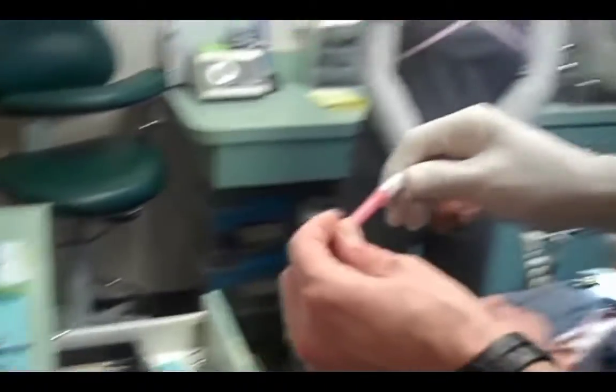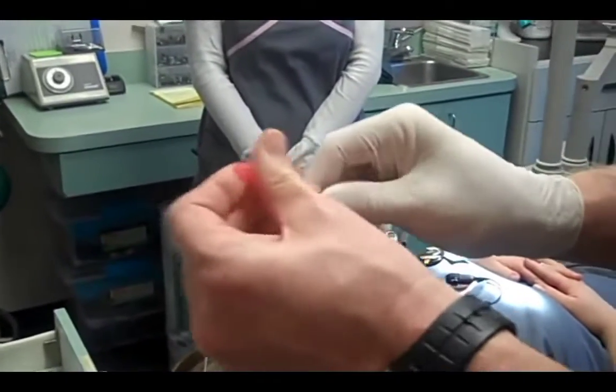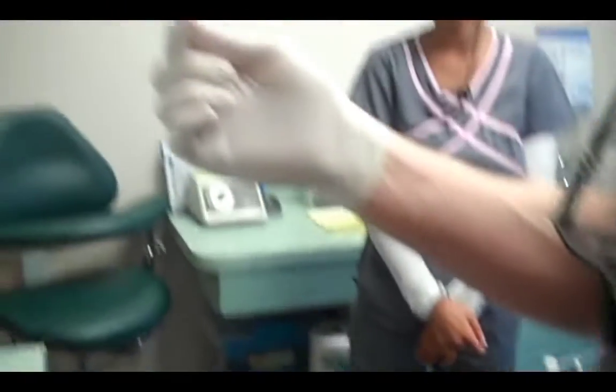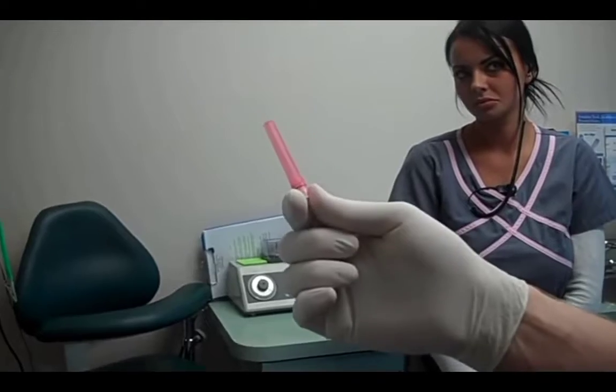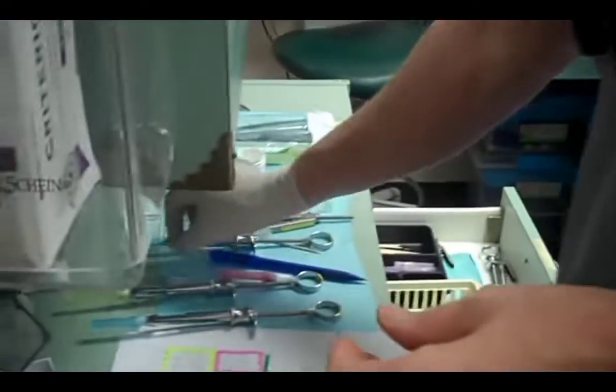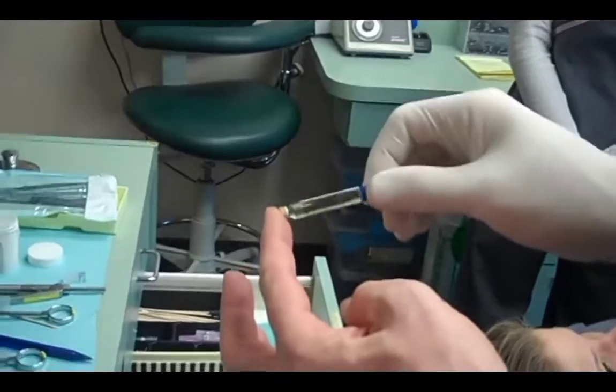There's also this 25 gauge needle. This is a big needle. We rarely use this. We use it almost entirely for oral surgery. Rarely used, but just so you know what that is. Also, this blue one called Marcaine. We almost always use that only for oral surgery.